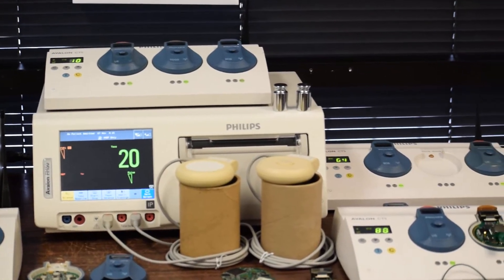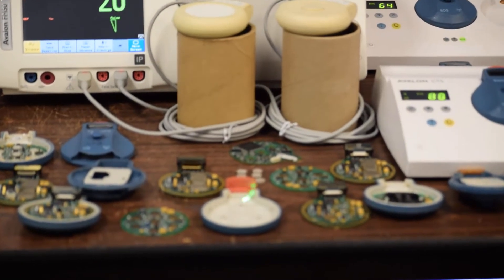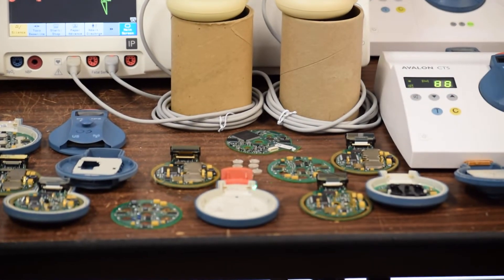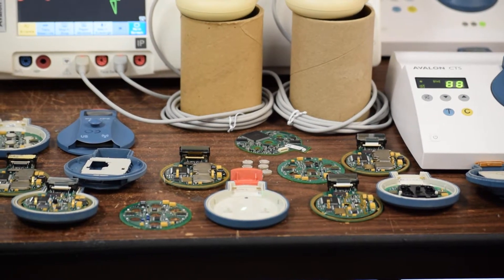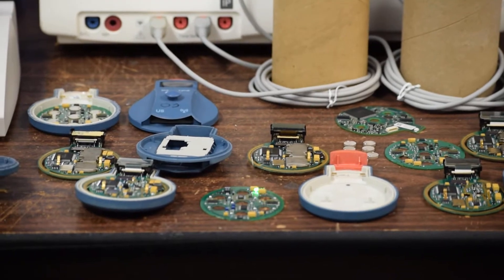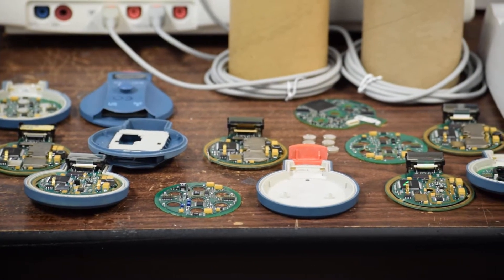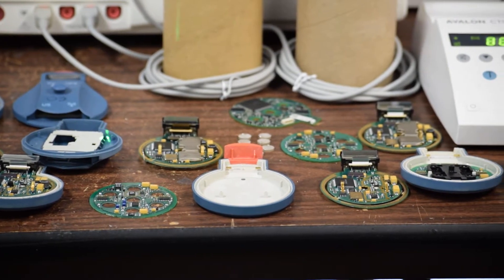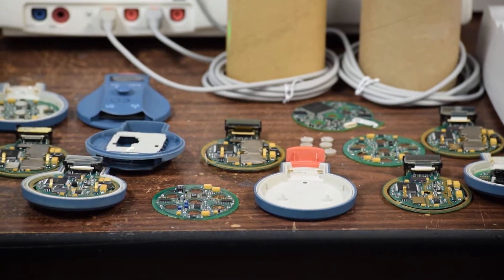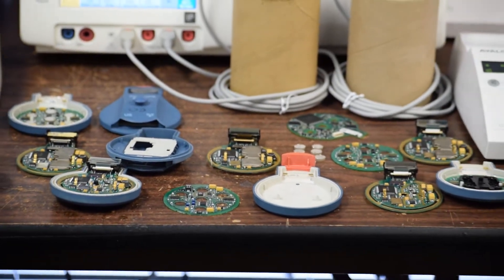Here you can see a transducer which has been completely dismantled. This is the M2726A with a red tab — the ultrasound wireless transducer. On the left side is the front-end PCB, and on the right side is the CPU main board. There is a top case here, and we dismantle these transducers without physically damaging them.